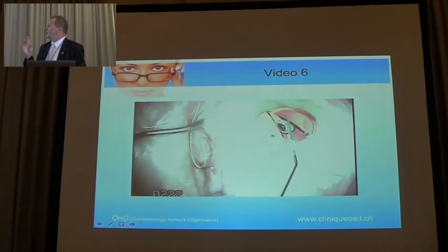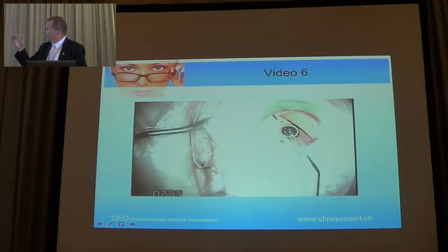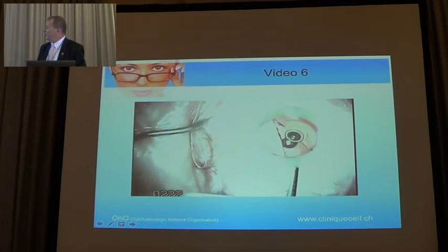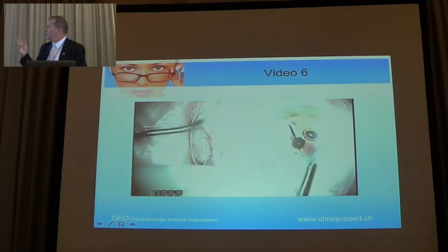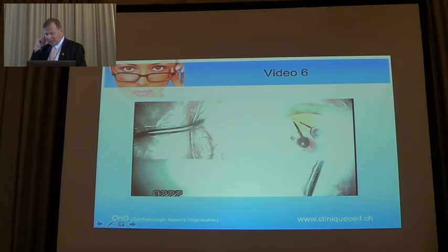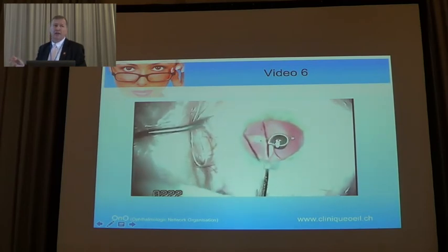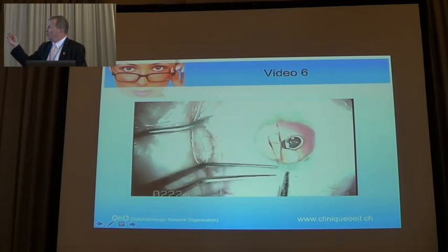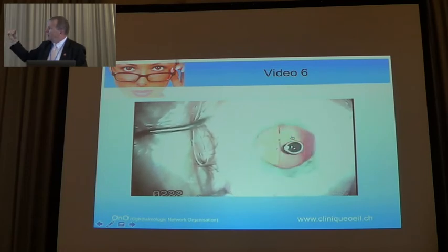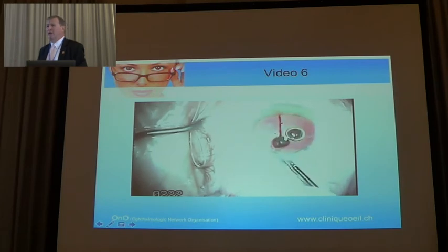Then you adjust your lens to put it in the main incision. You add OVD, then you take this little pincet with teeth, and you take out the first piece. You go very slowly, and the lens will shrink inside the main incision. And you take a MacPherson forceps when you have more lens, and you go very, very slowly, avoiding any fold. Then you take the other one, and so you are ready to implant another one.